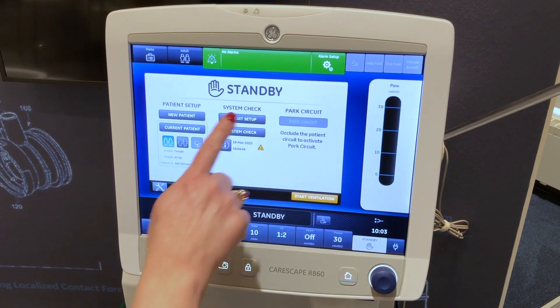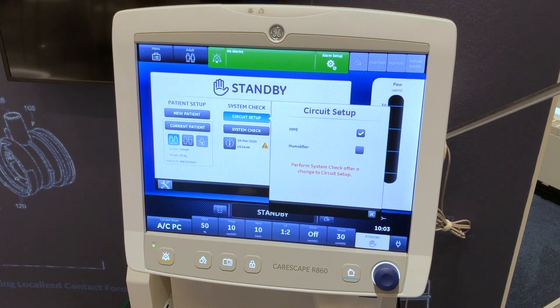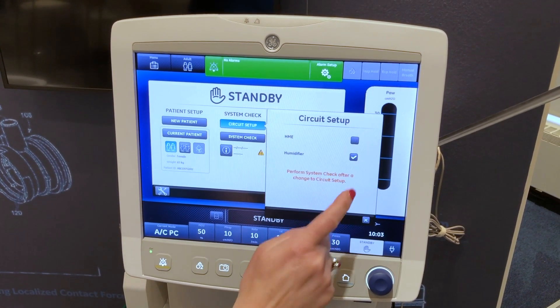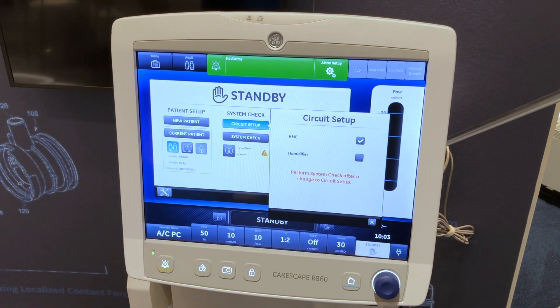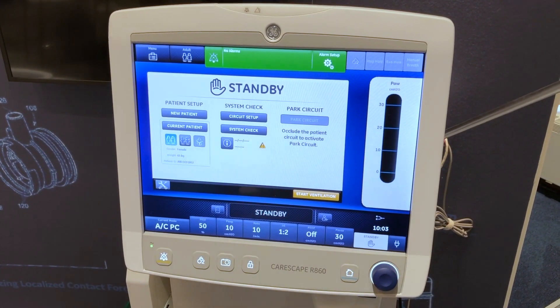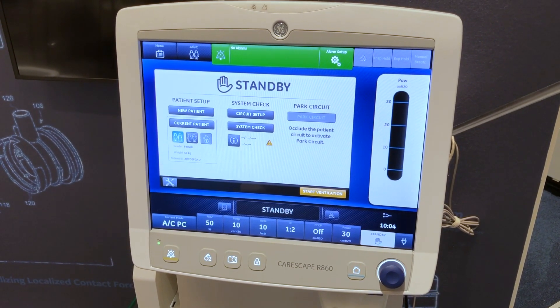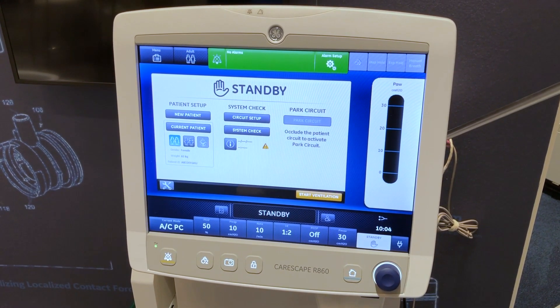Select circuit setup. Select the check box for HME or humidifier. Note the settings are confirmed when the setting is changed. Select X to close the menu. Use circuit setup to select settings that must be compensated for in the patient circuit measurements.